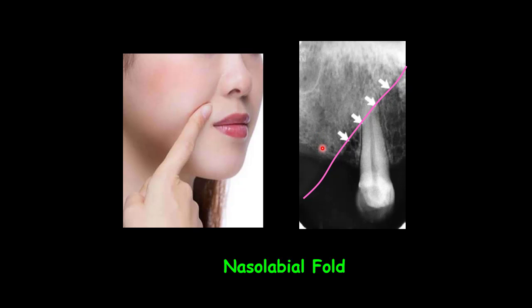In edentulous patients, where few anatomic landmarks are demonstrated, the nasal labial fold will be useful in identifying the site of the maxilla on periapical radiographs. On this periapical radiograph, this radiopaque line is from the nasal labial fold on this side of the patient — so this would be the distal side of our periapical radiograph and this would be the mesial side.